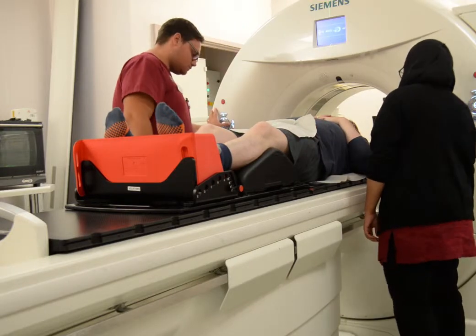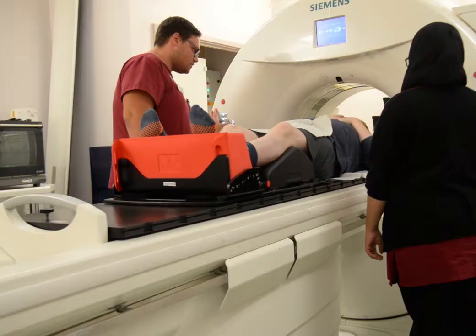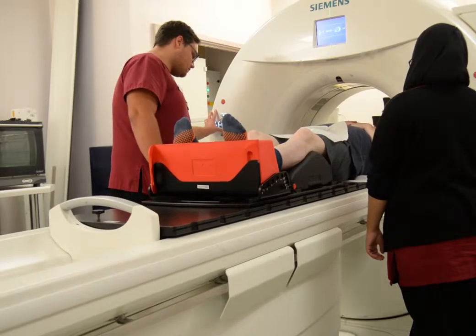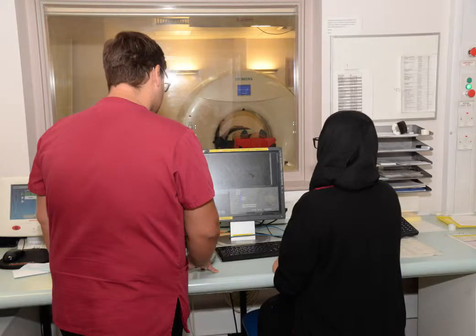The radiographers will move the bed up into the scanner. When they are ready, they will check you're okay, cover you with paper, and then they will leave the room. You will feel the bed move into the scanner and hear a noise while they are doing the CT scan. You will not feel anything and nothing will touch you. The scan will only take a few minutes and the radiographers are watching you all the time through a window. If you need them, just call out and they will come straight into you.